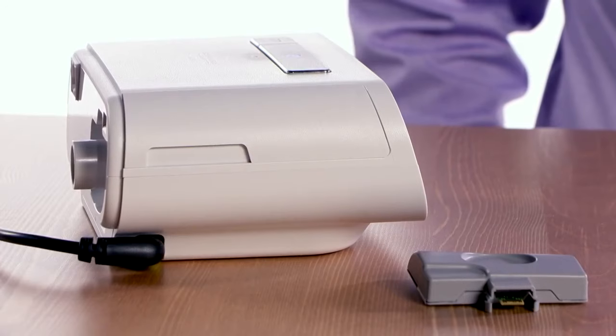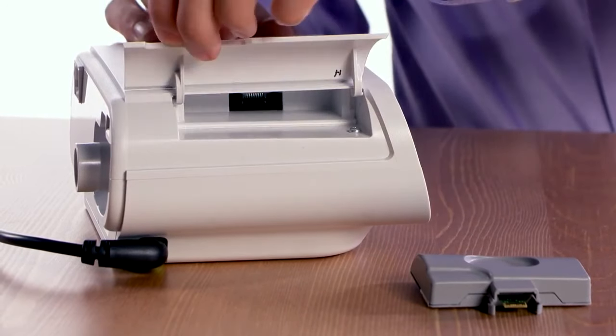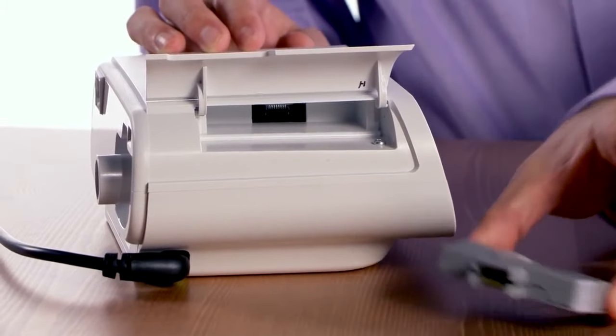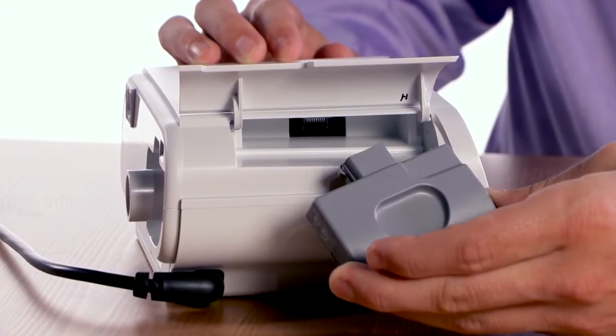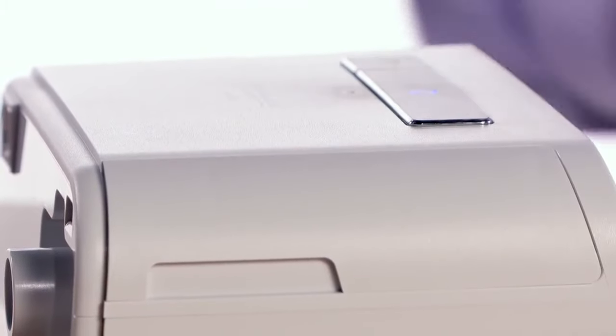To install a modem in your therapy device, open the accessory door and insert the modem module into the accessory bay, connector end first. Gently press the modem until it clicks into place, then close the accessory door.